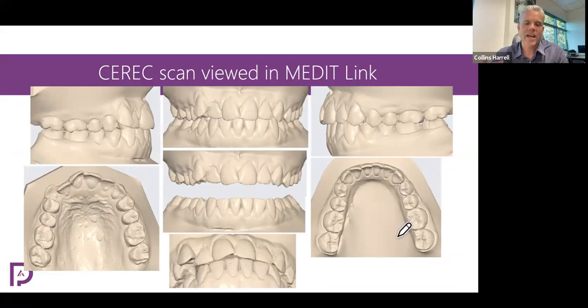So we would expect that when this patient gets her teeth straightened, we're going to see an overjet problem, unless we deal with the class 2 and either move the upper teeth back or move the lower teeth forward. And also remember, we had that Bolton discrepancy with this patient. She has more tooth mass in the upper than the lower. So that's another reason why we would see the uppers advance more.